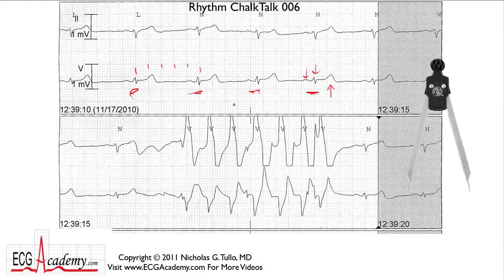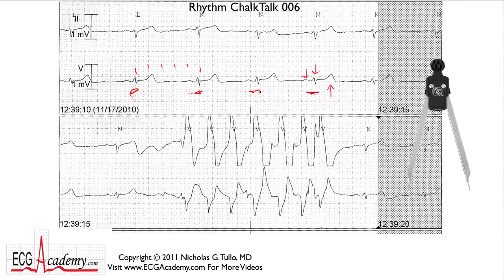Sinus arrhythmia is a slight irregularity in the sinus rhythm. It happens because the sinus node is influenced by changes in the autonomic nervous system. The vagal nerve in particular will cause very rapid changes in heart rate that can cause the R-to-R interval to vary from one beat to the next. But this is normal — sinus arrhythmia is considered a normal variant.